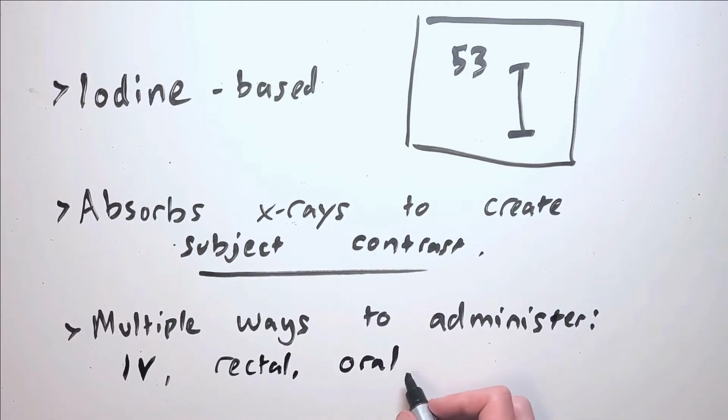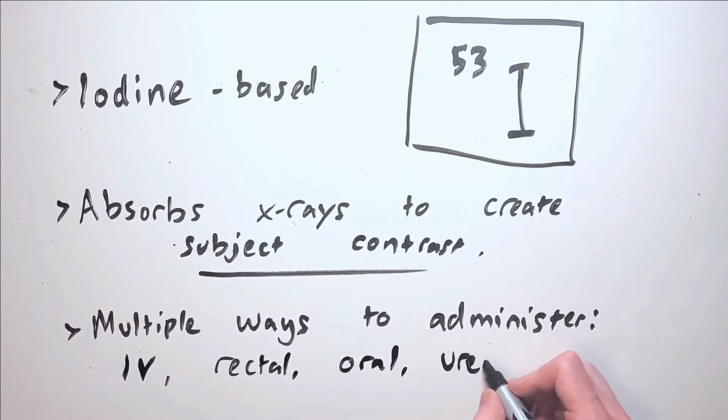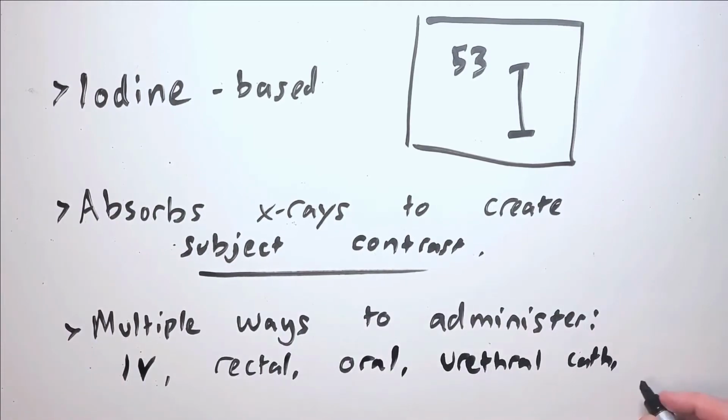There are also other routes of contrast administration, like rectally or through a urethral catheter or through an intraosseous access into the bone, but in this video we'll briefly discuss oral contrast, and then we'll primarily focus on IV contrast.